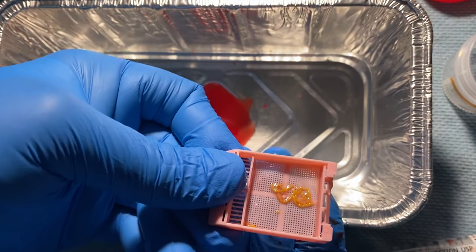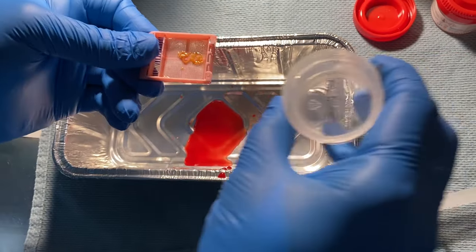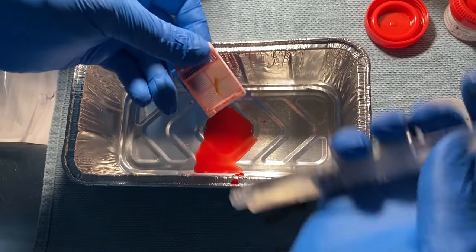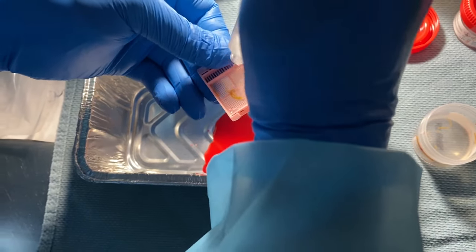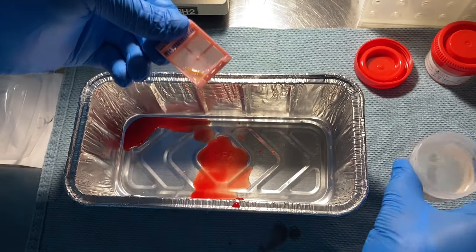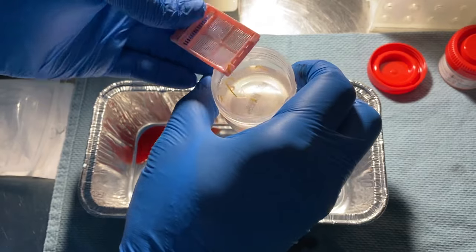Once the tissue is rinsed of any blood, the tissue sieve is examined to macroscopically assess adequacy of the specimen, and the specimen is then transferred to the surgical pathology formalin cup.